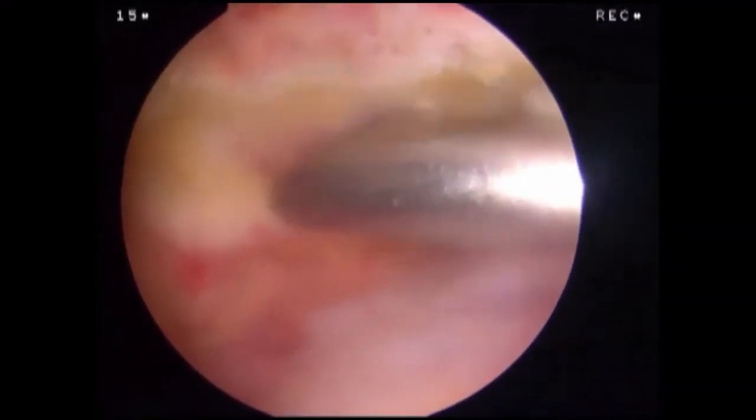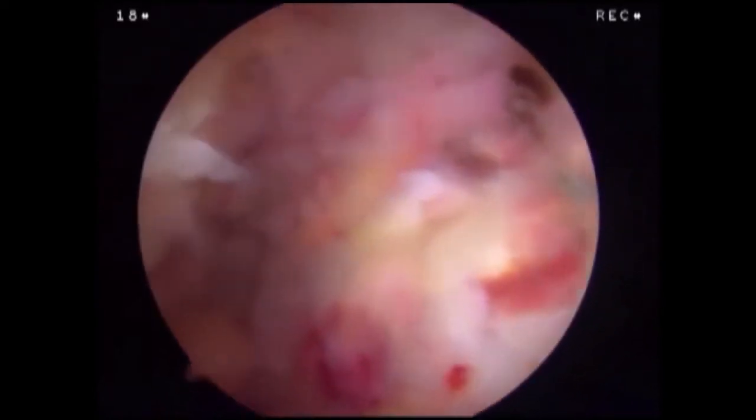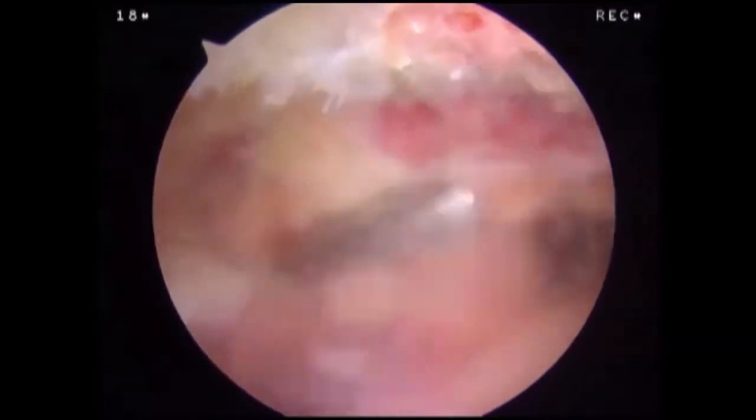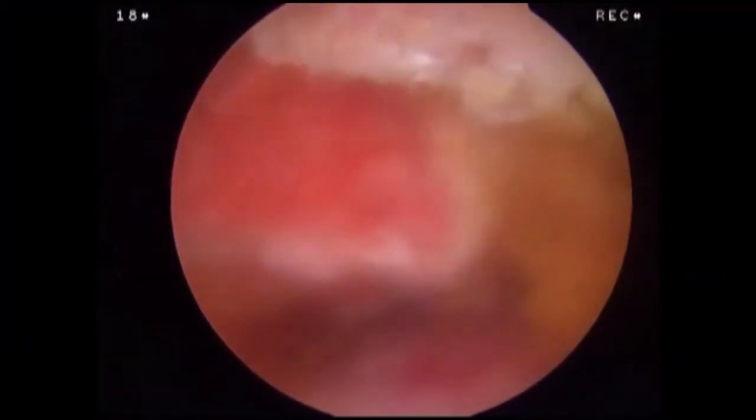The rotator cuff is repaired based on tear pattern and surgeon preference. The burr is introduced through the anterior portal and a distal clavicle resection is performed. Care is taken to leave the posterior superior AC ligaments intact. This completes our assessment of the subacromial space.